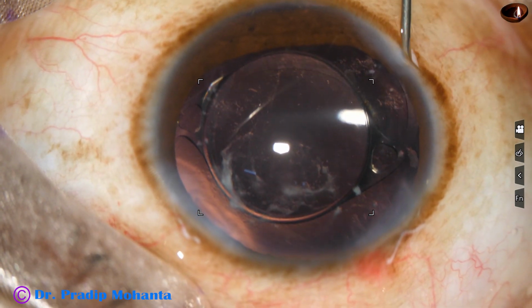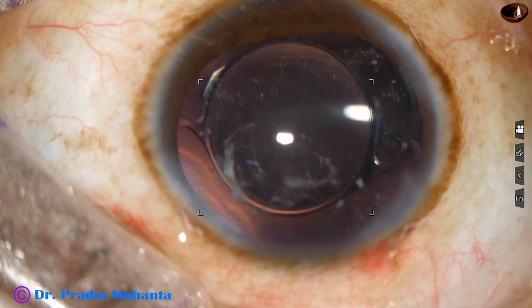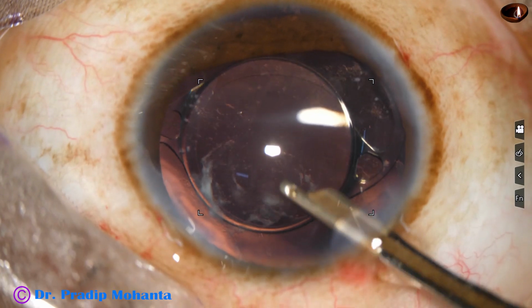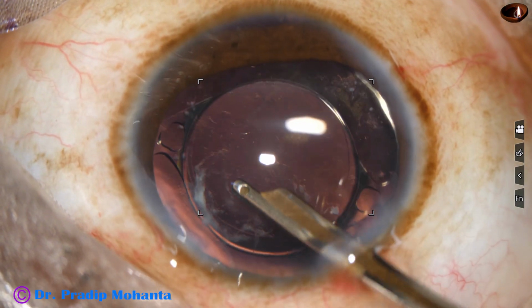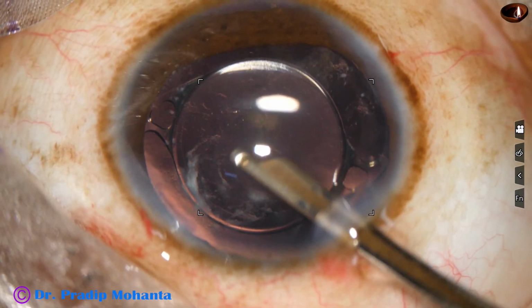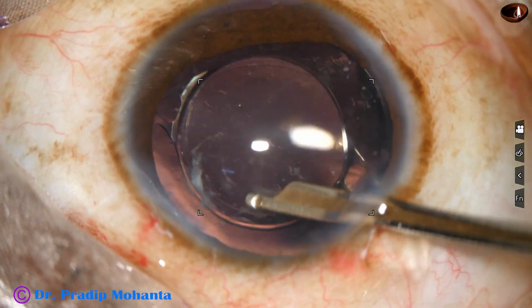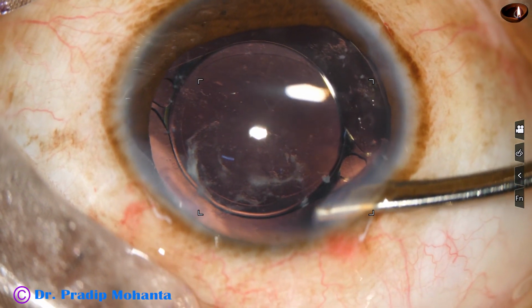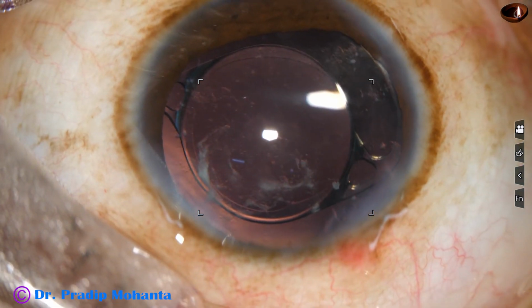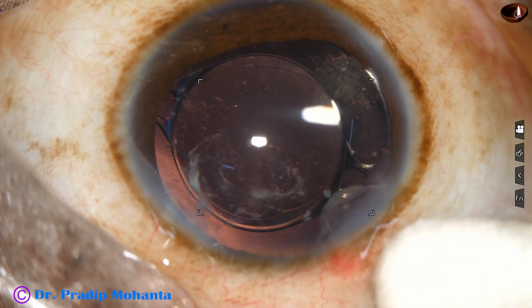You can design your own pre-chopper. It's just like a chopper with front edge sharp, the rear edge blunt, length should be about 1.5 to 1.7 millimeter. The sustainer should be about same length, 1.5 to 1.75 millimeter. You can design your own sustainer and pre-chopper and get it made from your manufacturer.